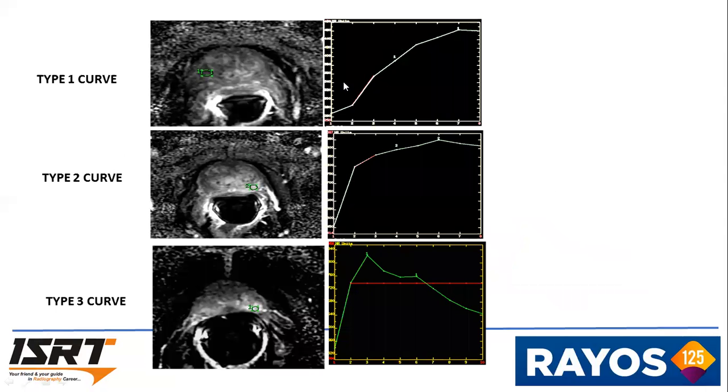Here we can see a type 1 curve. It is from here. This is a benign lesion. This is the type 2 curve. It is from here. This is an indeterminate type lesion. This is a type 3 curve. It is from here. This is a malignant lesion.